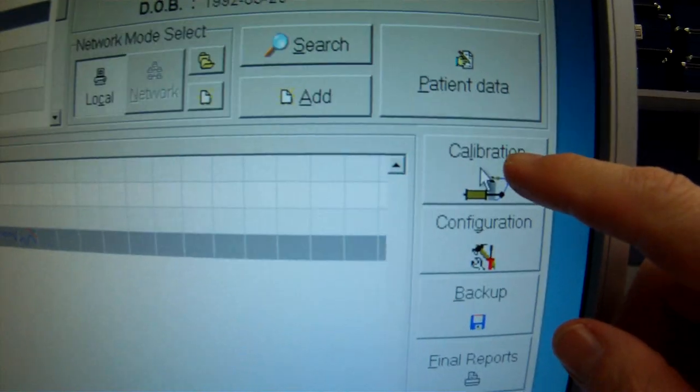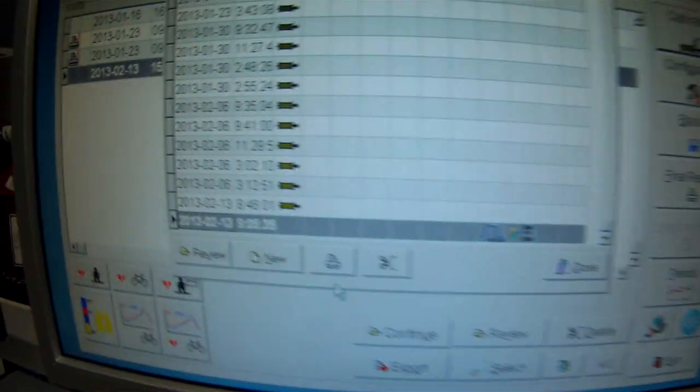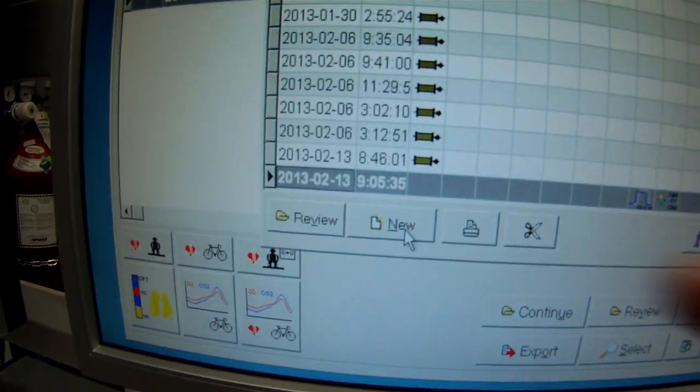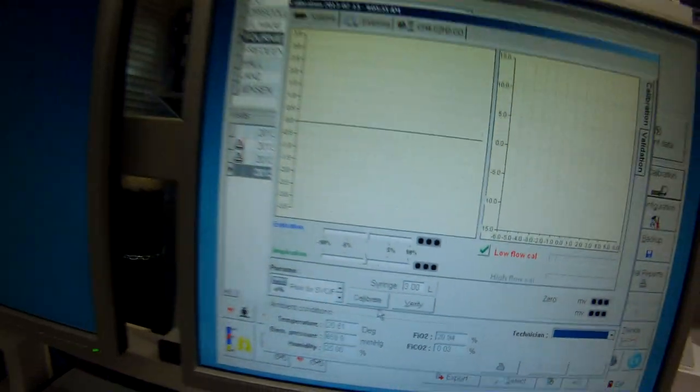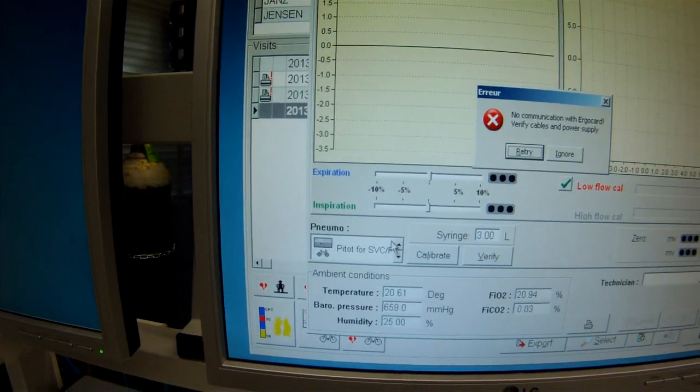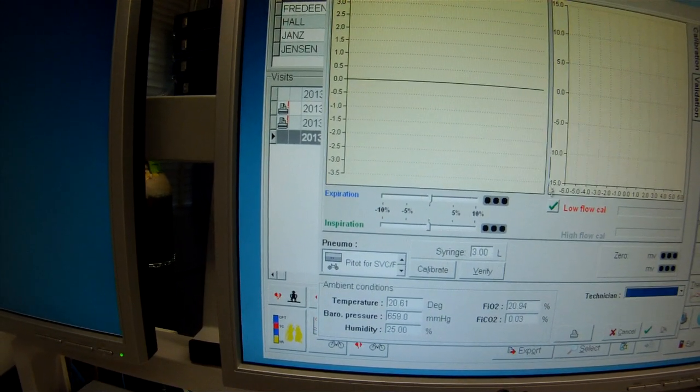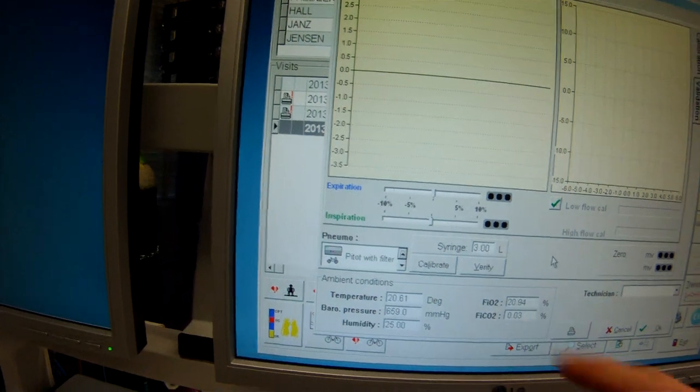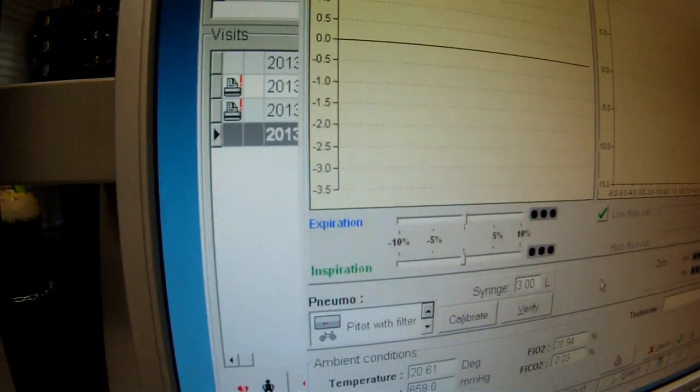So come over to our software. Here's our computer screen, and what we're concerned about here is we're going to do a calibration. We're going to do a new calibration. So we'll talk about new. And it comes up here now. Now, one of the peculiarities of this particular setup we've got here today is that we need to have this set to pitot tube with filter. We need pitot tube with filter established on that.